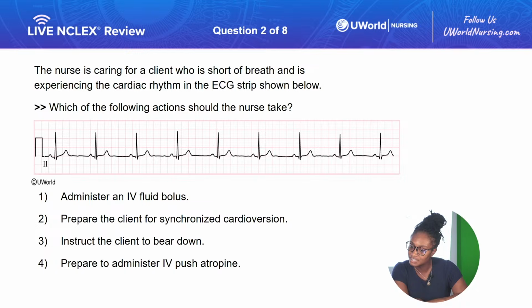Lots of good rationales. Good job, good job. So it's like, where were you 2 hours ago? I don't know if it was 2 hours ago, but we were live at 11 a.m. 10-second strip. I think y'all are doing just fine with this. Good job, guys. So I asked, what was the answer to the first one? That one was atrial fibrillation. I don't remember what. I think it was option 1. Make sure you're calculating your rate correctly.